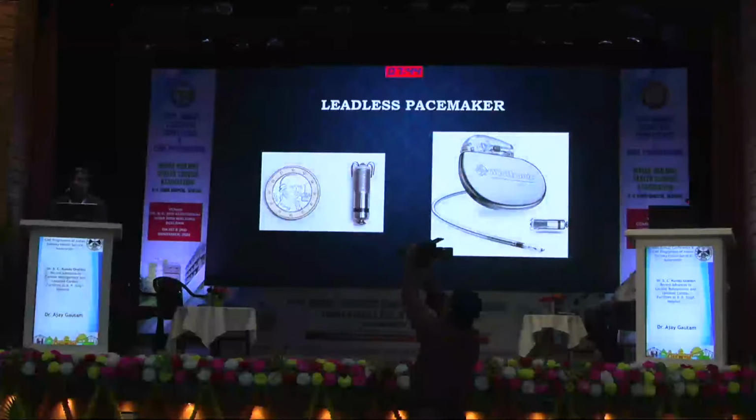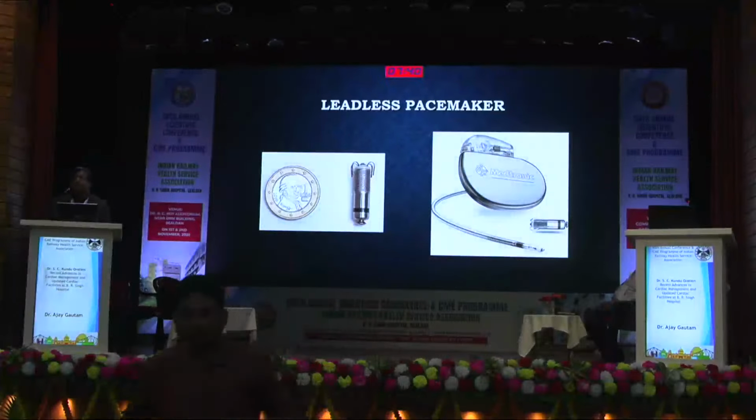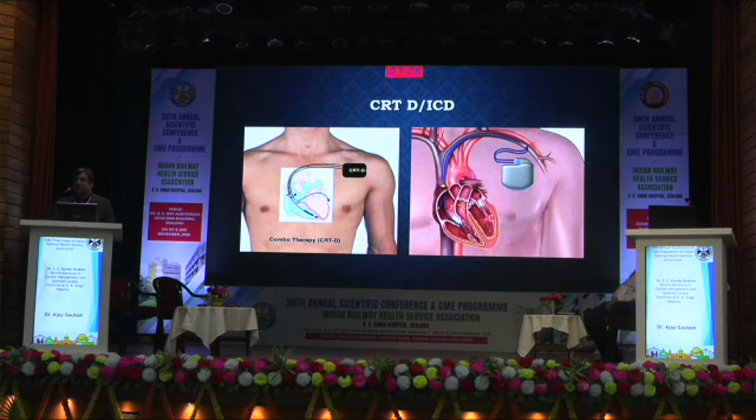This is the leadless pacemaker we have already discussed, a very small device. This is CRTD; on the left side you can see CRT, especially implanted in patients with severe LV dysfunction. It has been seen that if it's the right candidate, overall cardiac function improves, and quality of life and mortality benefit are also there. On the right side, it's ICD implantation, which prevents sudden cardiac death.